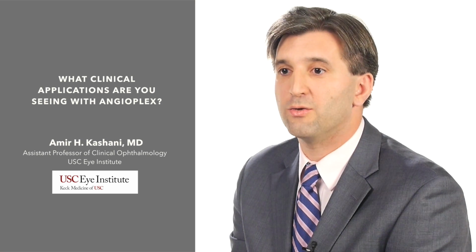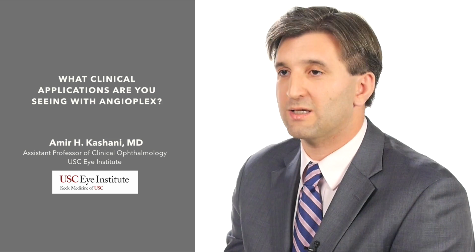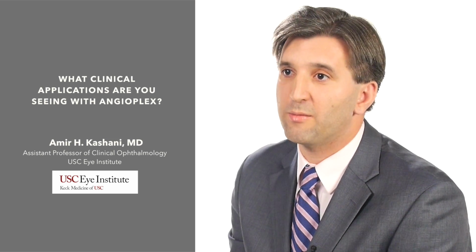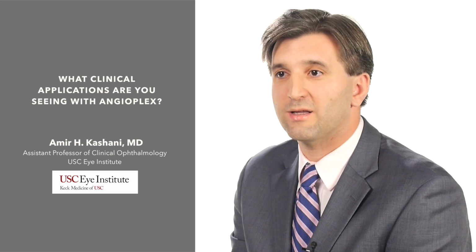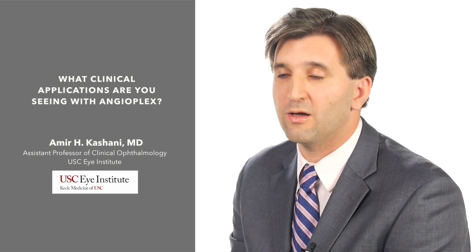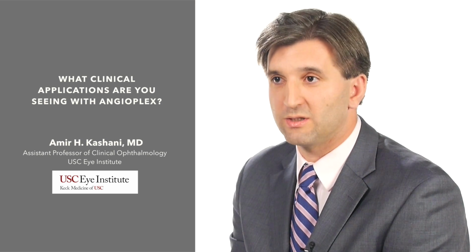And by doing that, you can actually evaluate the patient for the success of at least some treatments and the appropriateness of some treatments. So I'll give you one example. A lot of times we'll have patients come in with decreased vision and diabetic retinopathy, and we won't know if that's because there's macular ischemia, which is lack of blood flow in the retina, in the macula, or if there's edema. So what we'll do is a fluorescein angiogram and an OCT.